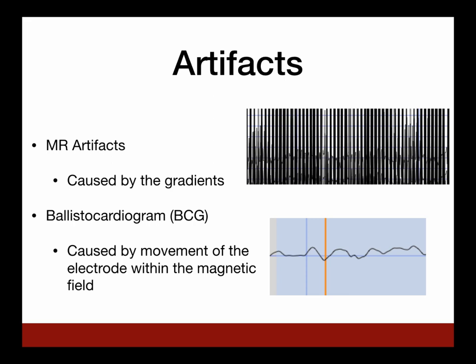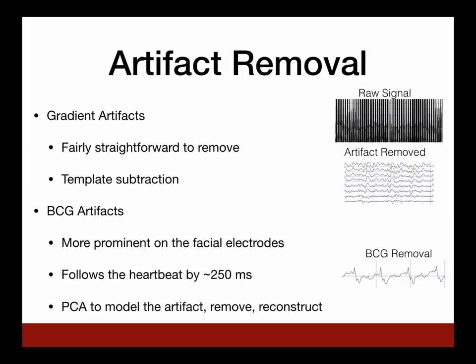And in most cases, BCG is going to be referring to your heart beating. And since most people can't stop their heart beating at exact moments, this is sort of unavoidable. But what causes it is your heartbeats and the electrodes, particularly on your face, which is a little bit more fleshy, tend to move slightly inside a magnetic field. Anytime that you have a metal wire inside of a magnetic field, if anyone has a Sonicare toothbrush, it conducts electrical currents, which causes little bits of distortion.